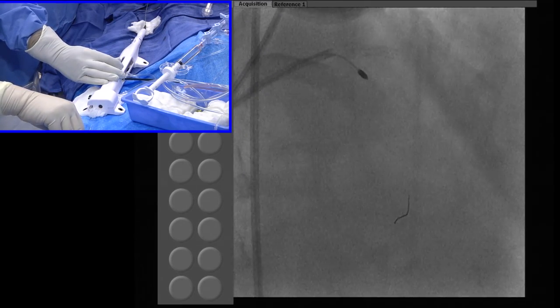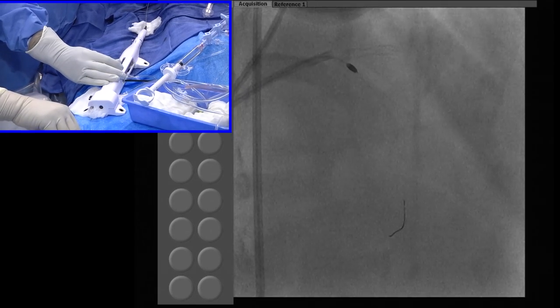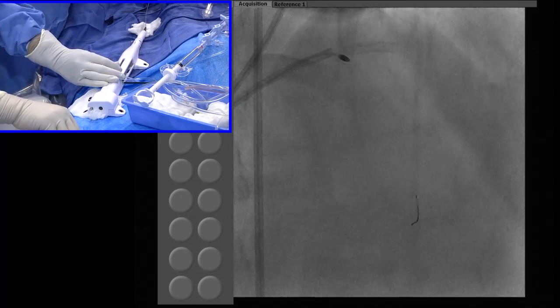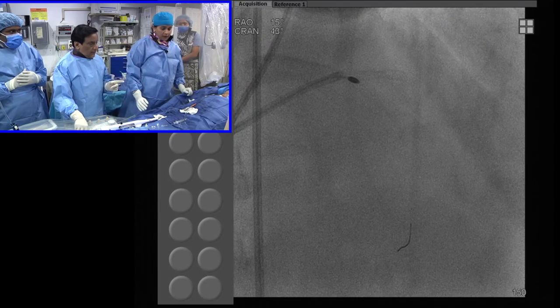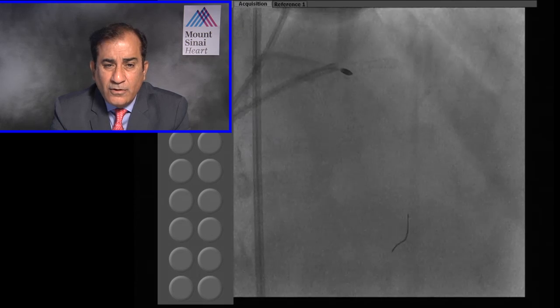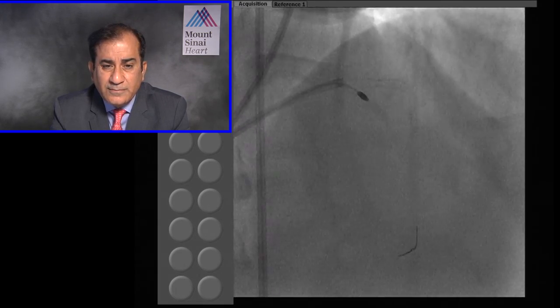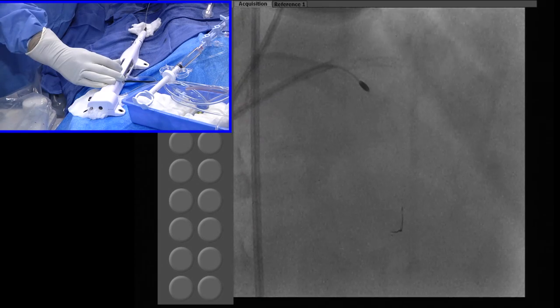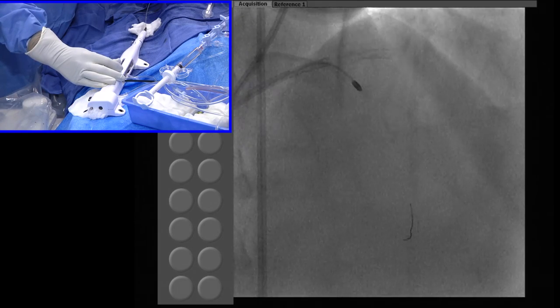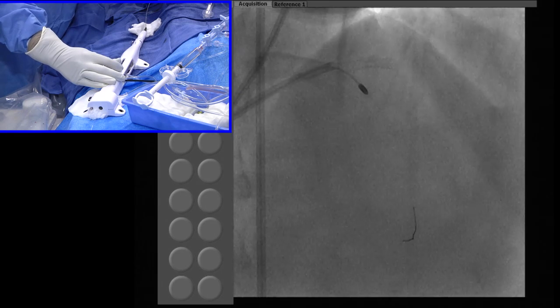The guide is too much. No? Definitely looks a bigger burr. So, Samin, if for whatever reason somebody did not want to or could not do rotablation, how would you suggest treating this lesion? No, this one I think you can use a high pressure balloon dilatation if required, which is completely fine also, because this is not a tram track both wall calcium.